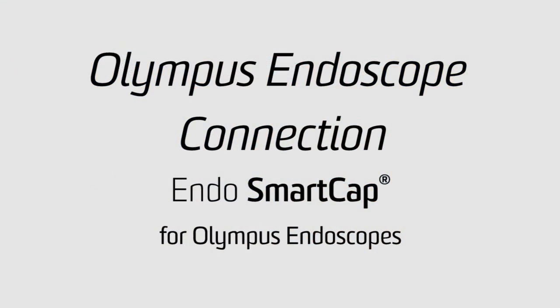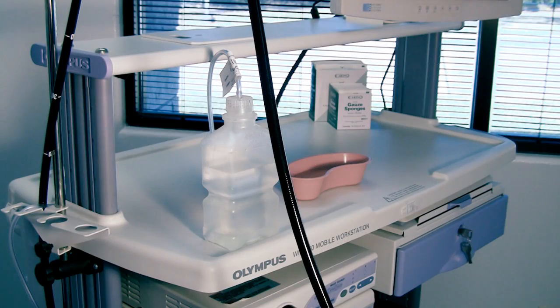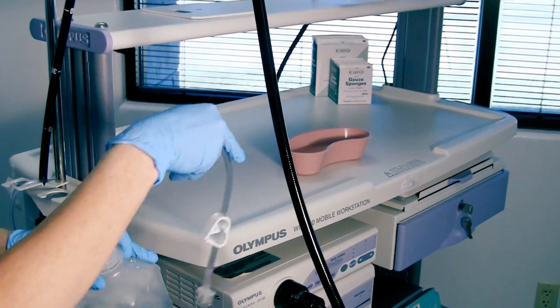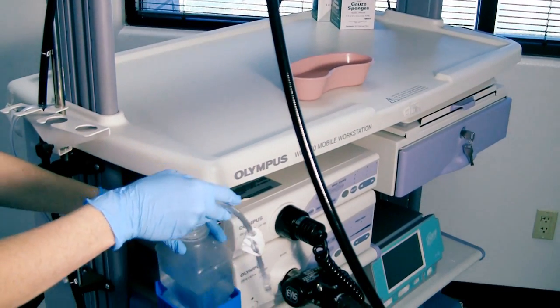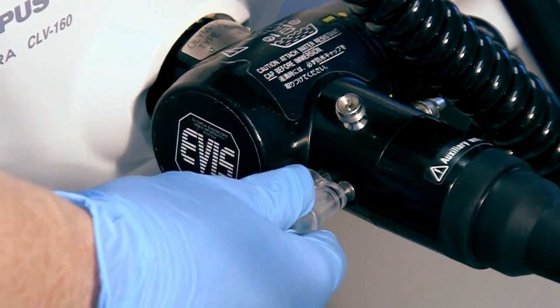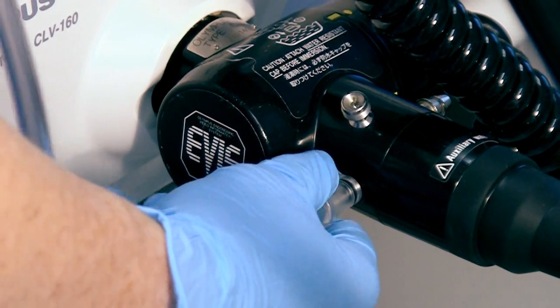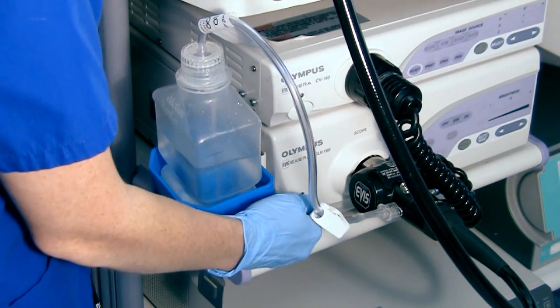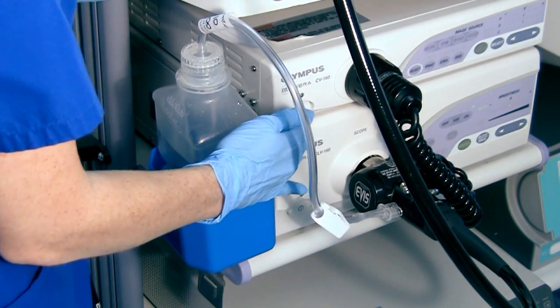The Endo Smart Cap for Olympus scopes is designed to be used with all GI scopes from the 100 series through today's 180 series scopes. After connecting the blue water bottle holder, which clips on the same as the reusable water bottle, place the sterile water bottle with the Smart Cap next to the processor. Next, take the distal tip and push it slowly onto the air-water connector of the scope. Note that the Smart Cap can go directly on, unlike the reusable water bottle. Once it has securely clicked into the scope, turn on the processor and light source.